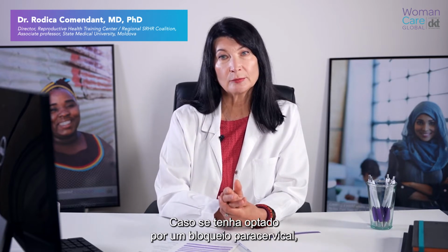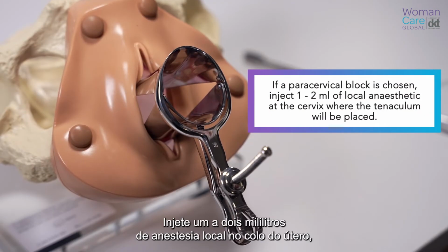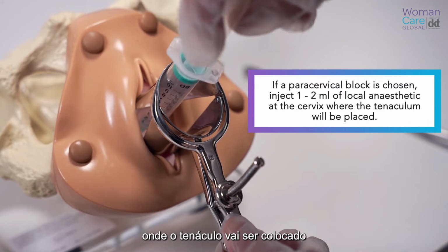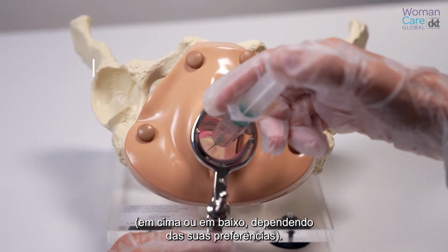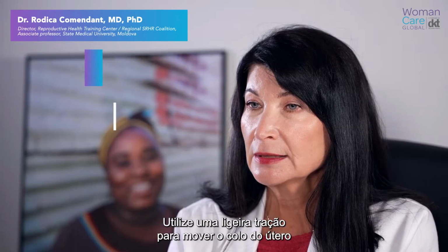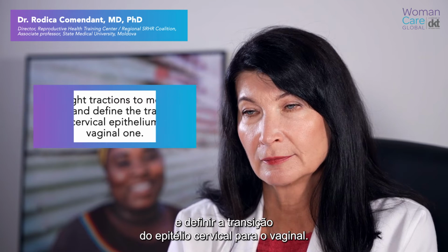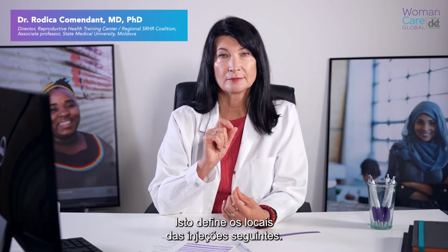If a paracervical block is chosen, this is performed as follows. Inject 1 to 2 milliliters of local anesthetic at the cervix where the tenaculum will be placed, either at 12 o'clock or 6 o'clock, depending on your preference. Stabilize the cervix with the tenaculum. Use slight traction to move the cervix and define the transition of the cervical epithelium to vaginal one. This delineates the sites for next injections.